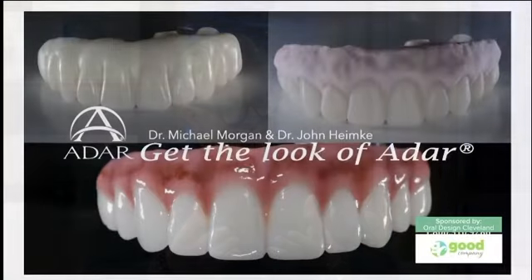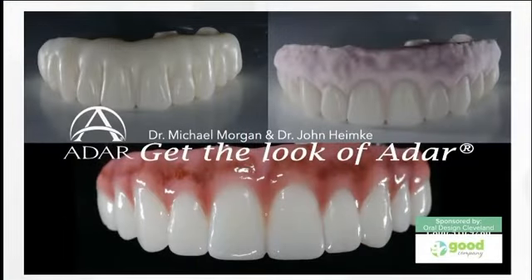Yeah, and you know, the process is fairly straightforward. We do a 2D digital smile design. Then I have a team, myself, that organizes the case and designs it, then the surgeon, and then we have laboratories, a local laboratory, and then finally Pincus Adar in Atlanta. As you can see on the prosthesis here, this is a prosthesis that is milled with a multi-milling machine that makes it into a form. It's kind of like chalk, and then they bake it in a special computerized oven, and then look at the beautiful result that happens at the end.